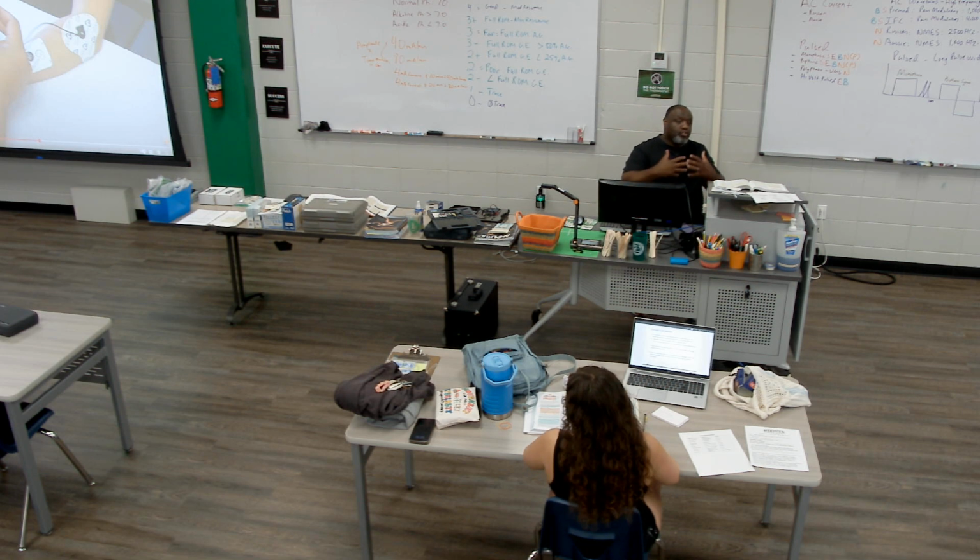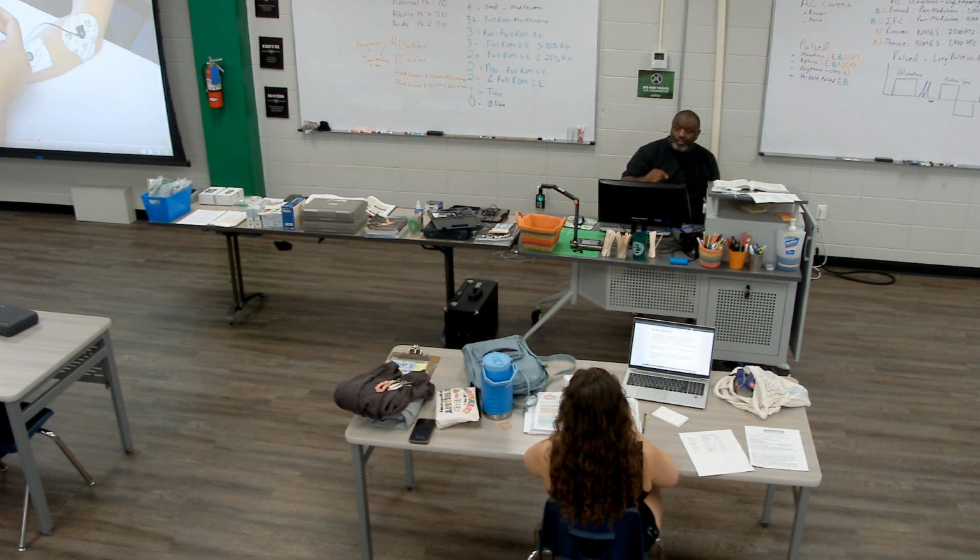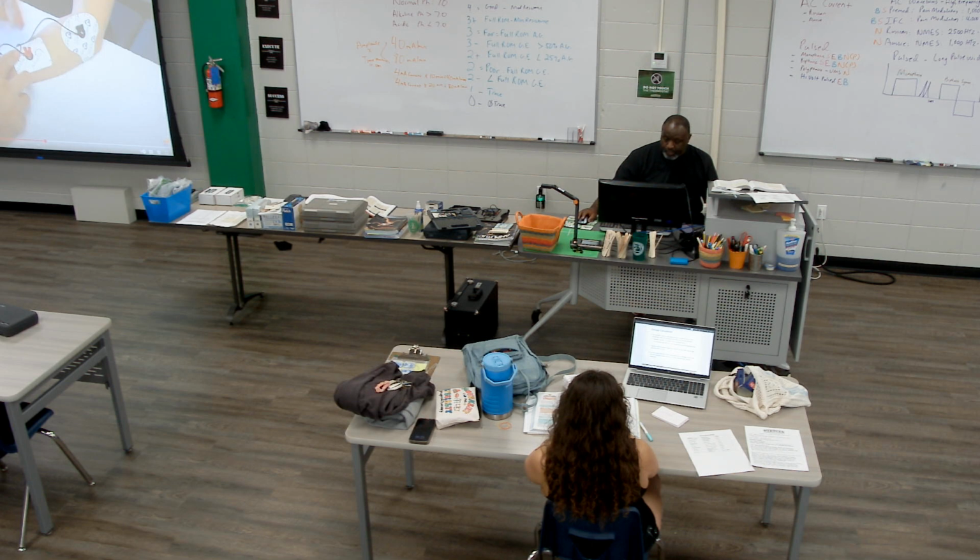So they're trying to use the same charges to repel the negative drug or the negative medication into the skin through those shunts, through those areas where we can get things through the skin easier, hair follicles, sweat glands. We're trying to push it through those areas using an electrical current. So the medication is negative as well as the electrode, so they will match, because like charges repel, opposites attract. This is determined by the polarity of the medication.